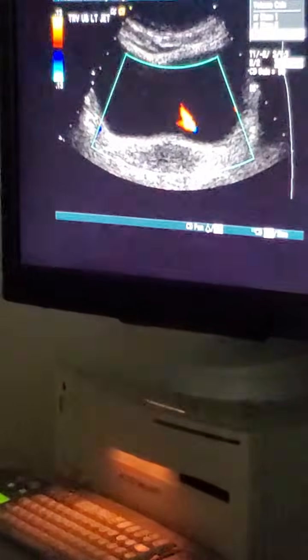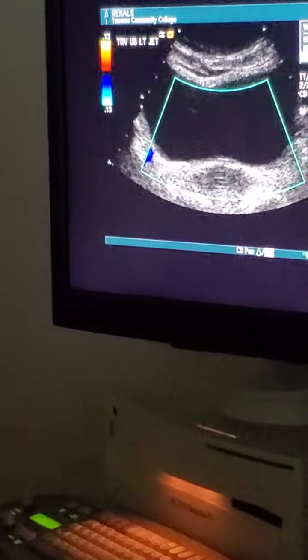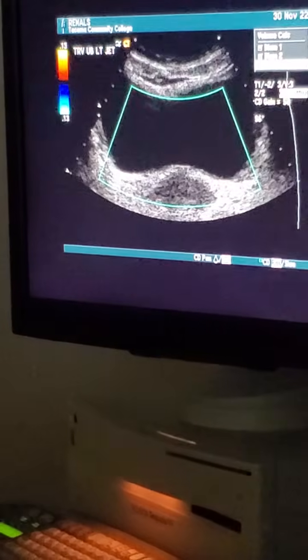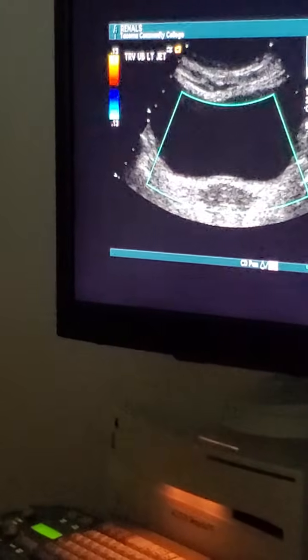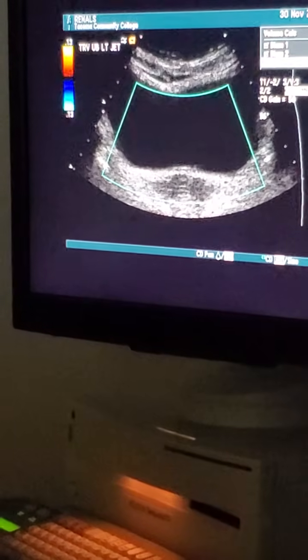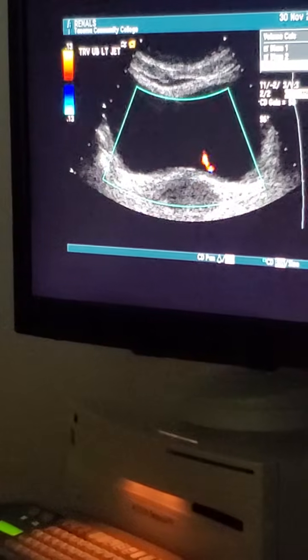Okay, right. You're going to get to doing your job here. But the urinary bladder isn't part of our exam protocol, right? No, but we're doing renals today, so it's part of a renal exam. Okay. So I just want to get you guys some background on it before we hit it really hard third quarter. How many of both do you need? Just one, but I figured.